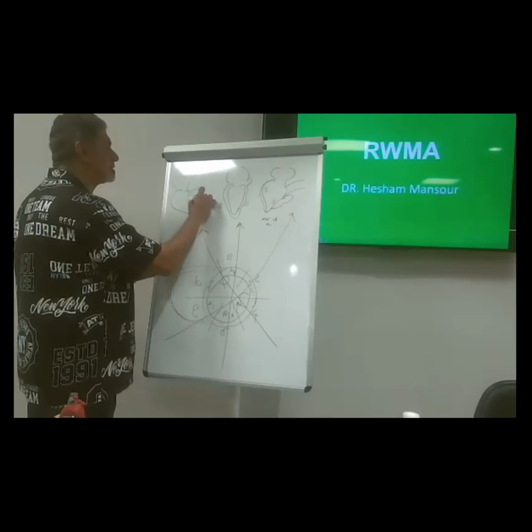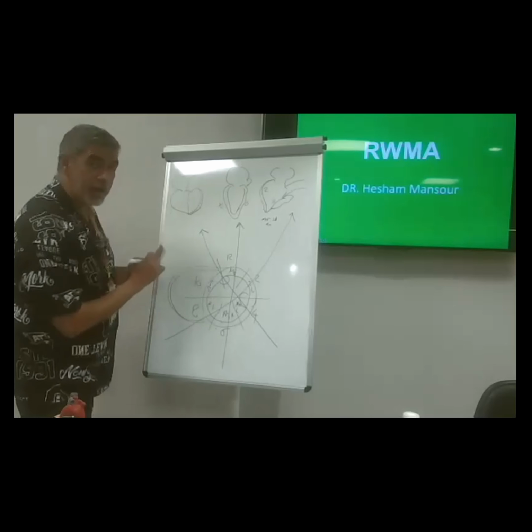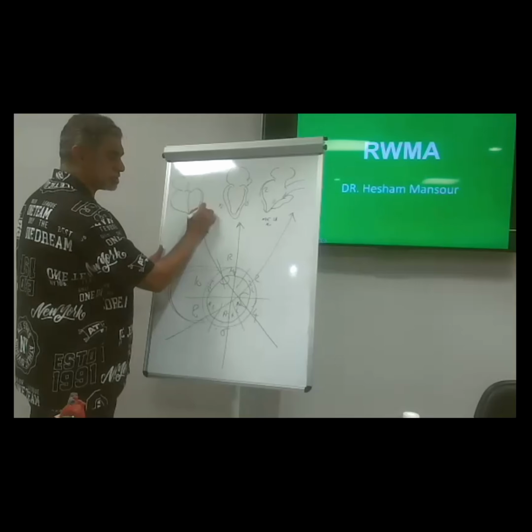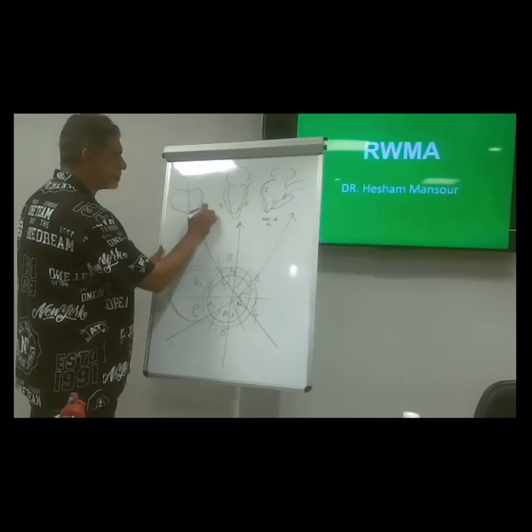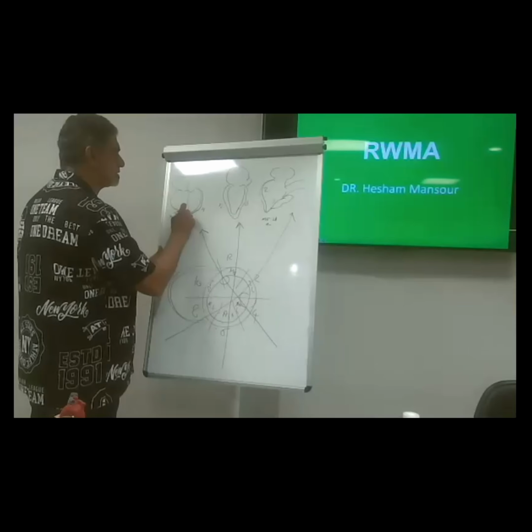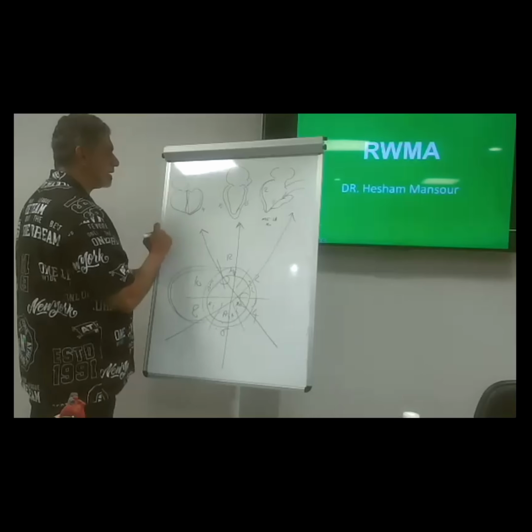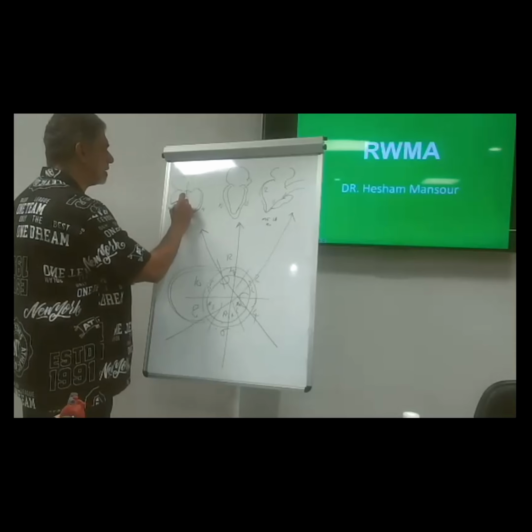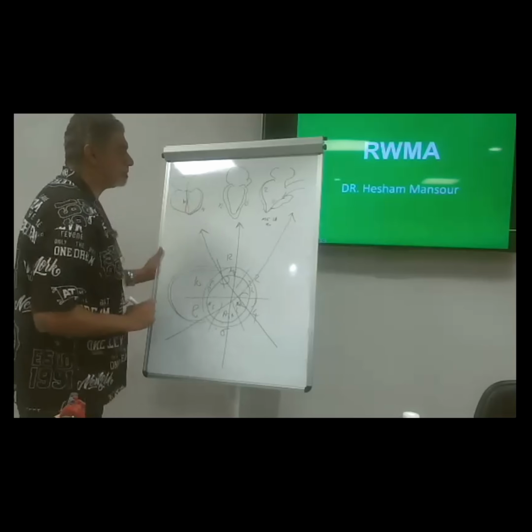What is this? Anterolateral. This is what number? 4 o'clock. And this? Inferoseptal. What number? Okay.